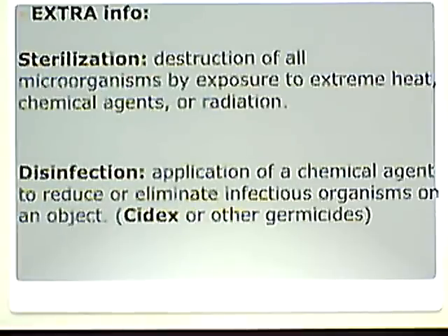So here's some extra info. Sterilization, okay? We're going to talk about cleaning these probes. Sterilization is the destruction of all microorganisms by exposure to extreme heat, chemical agents, or radiation. They do this in surgery a lot with all those reusable tools. They clean them, then they sterilize them, okay? Sterilization is by extreme heat. All microorganisms are destroyed with sterilization. Why? Because it uses extreme heat.